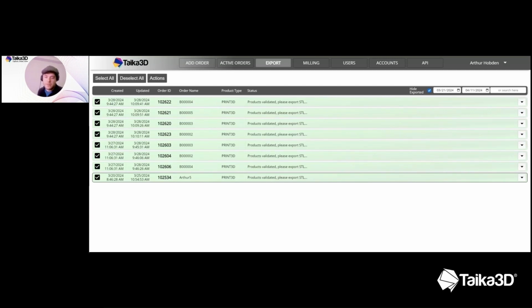People are writing up on those order forms. That gets sent out to invoicing. Invoicing has to retype it in. There's all these extra steps around orthotic design that can really bog you down. And Taika 3D's platform really tries to strive to bring you automation at every stage, not just on the CAD side, but with all the other paperwork around the orthotics production.